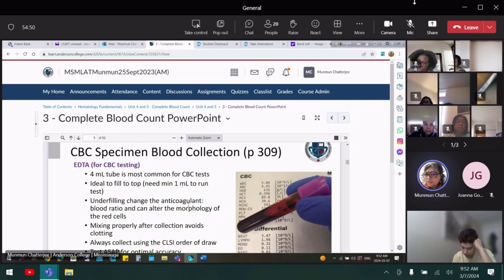They have been standardized in such a way that in a 4 ml tube, if you can get 3.5 ml or 3 ml of blood, it is fine. But sometimes there is a difficult patient and you cannot get the blood, or a baby, I should say a kid. A very skinny baby is not good to draw too much blood from, or someone who is too anemic. In that case, the criterion for the CBC tube is that you have to have a minimum of 1 ml.